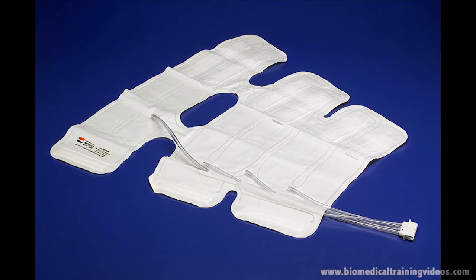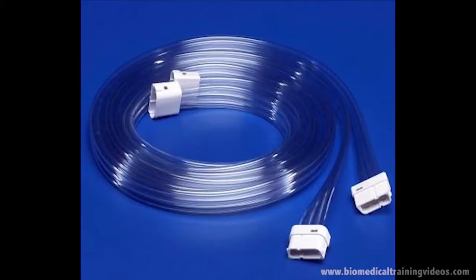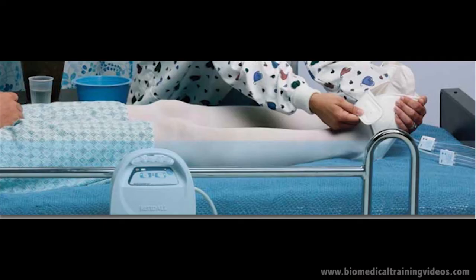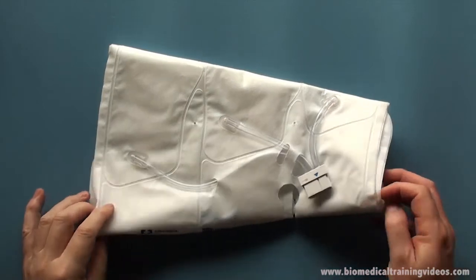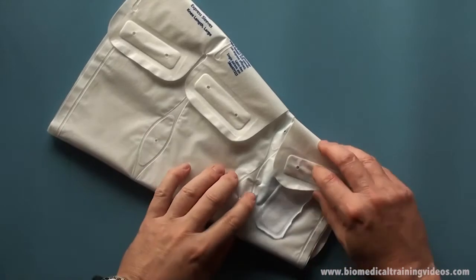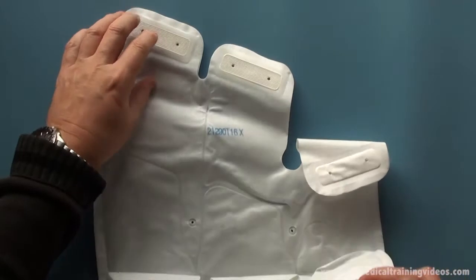This is the sleeve called a leg sleeve and this is showing how it is placed on the patient. This is the interconnecting tube. And this is called a foot cuff and how it is applied to a patient. Now just showing you what a leg sleeve looks like in a bit more detail. There are three distinct sections: the ankle, the knee, and the thigh.